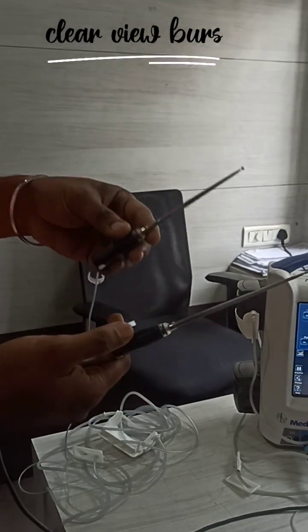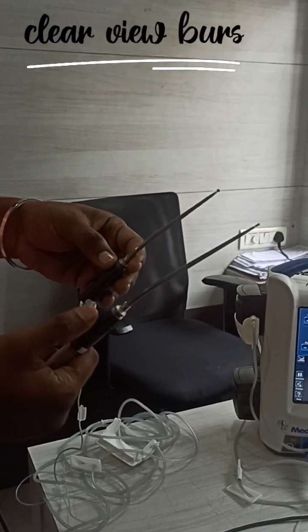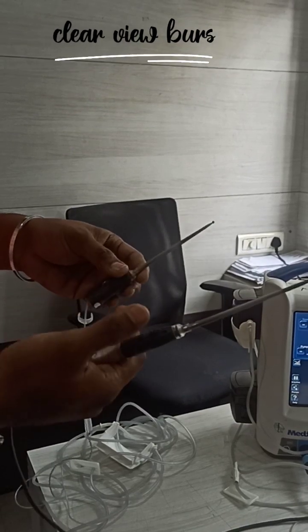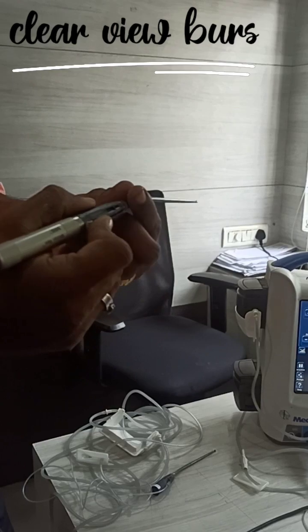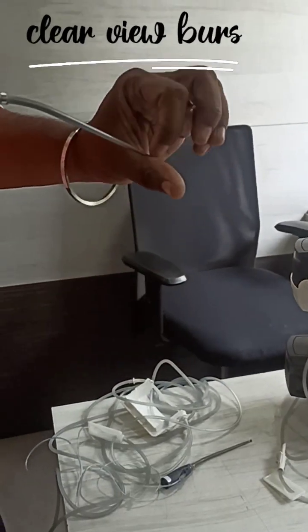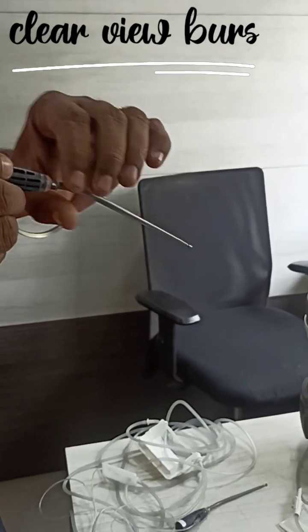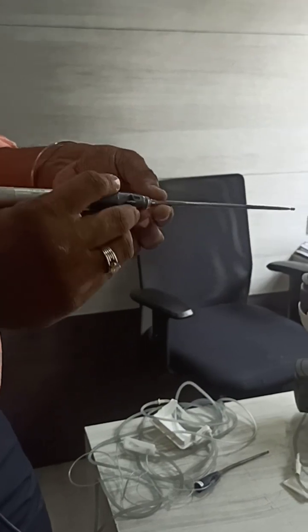We have different sizes - this is 12 cm and this is 14 cm. Ball and diamond tools are available. You can see the slimness - it is very sleek and has a tapered design. When you are doing surgery you have a clear view, which is why they named it the 'clear view' burr.